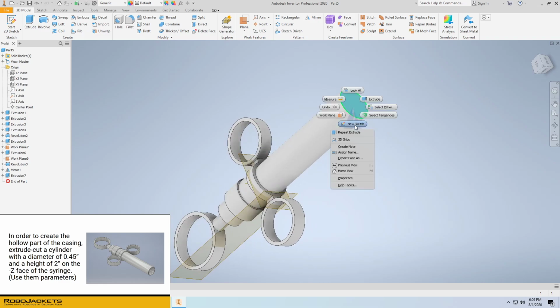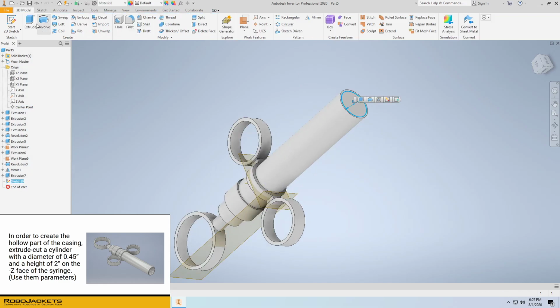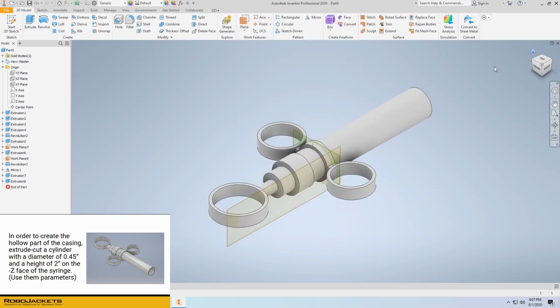Create yet another sketch. This one's going to be 0.45 in diameter, which is 90% of our main diameter. Times 0.9. There we go. Finish that up. Grab that sketch and extrude it inwards. Once again, 2 inches, but we want to make this based off of main thick. So main thick times 8. And make sure to turn it into a cut in the opposite direction. Here we go. And now the cylinder's hollow. I can't really see it from this view.